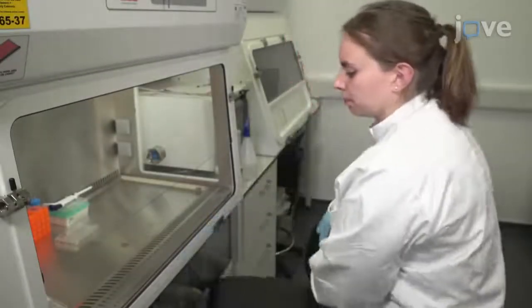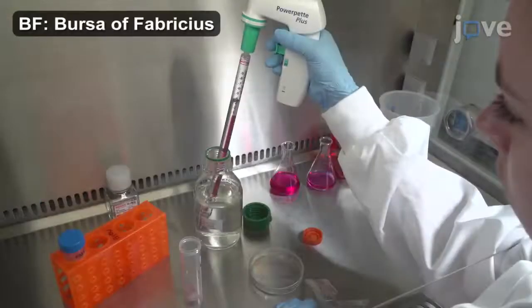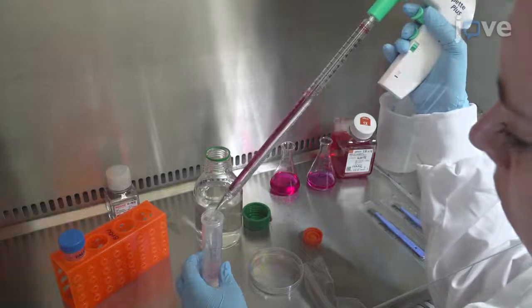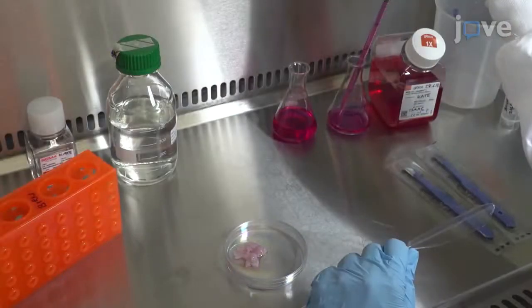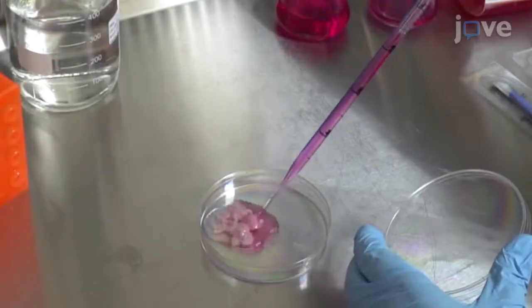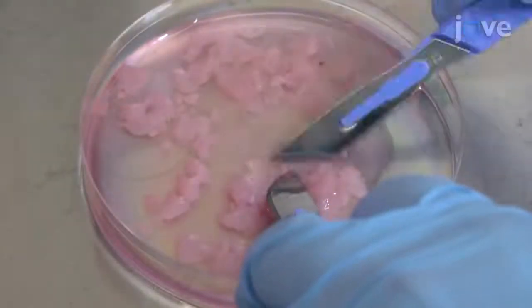In a microbiological safety cabinet, wash the BF in 30 milliliters of cold PBS at least three times. Transfer the washed tissue to a petri dish and add five milliliters of 1x collagenase D solution.